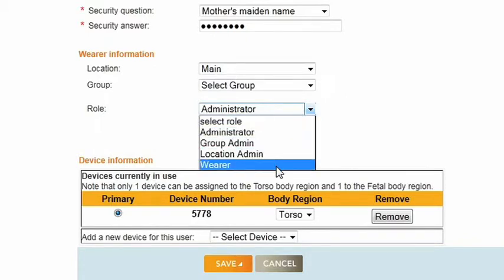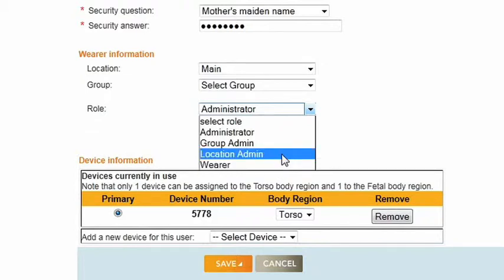The Wearer role allows limited access to functions on the site. A wearer can only perform readings on devices assigned to them, and reports run by a wearer will only contain their dose information. Wearers can update their email, phone, and password.